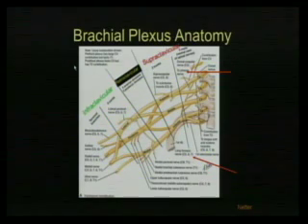So once you find this first rib, more horizontal, lying between the two vessels and the clavicle all in the same plane, you know where your nerves are, look for an abnormality there, and then just work your way lateral to see if it involves anything else.